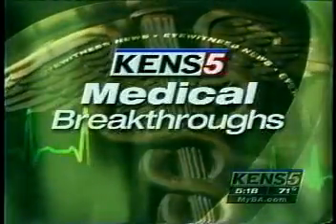Ken's 5 Eyewitness News at 5. A San Antonio dentist is offering a new kind of gum surgery that promises less pain and a quicker recovery. He uses a laser instead of the conventional scalpel and stitches. Wendy Rigby has more on this medical breakthrough that promises a kinder, gentler approach to a cure.